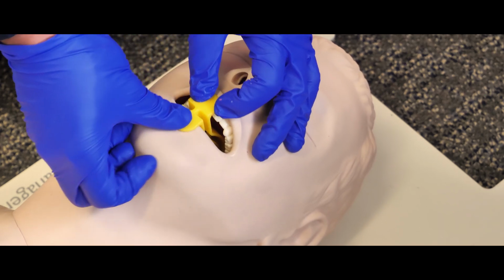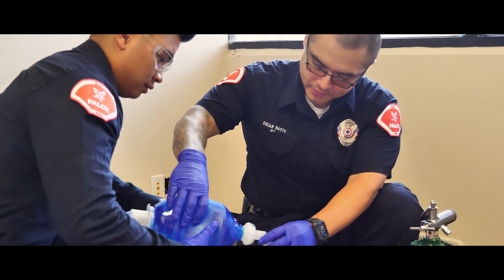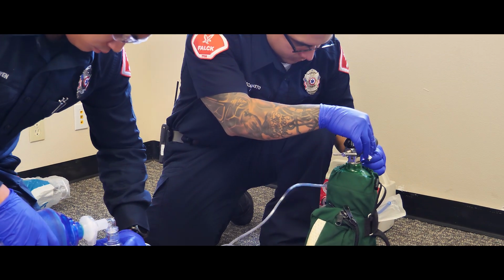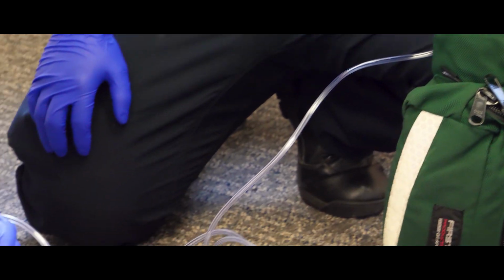The EMT checks to make sure the patient does not gag on the OPA. The EMT should immediately begin ventilations, as the OPA insertion should not take more than 30 seconds. If your partner has not attached the BVM to high-flow oxygen, that should be done now.